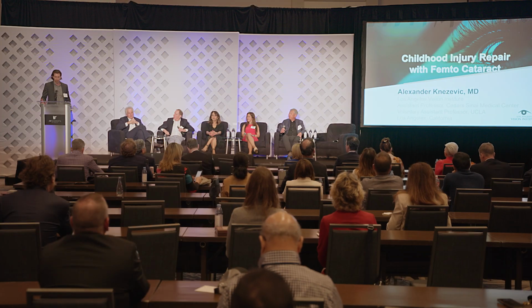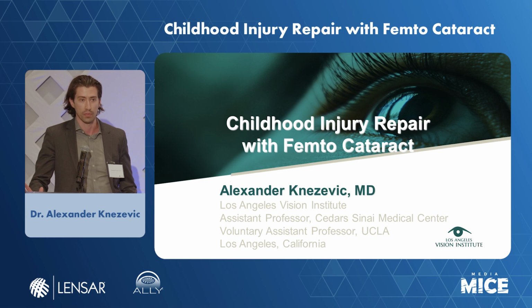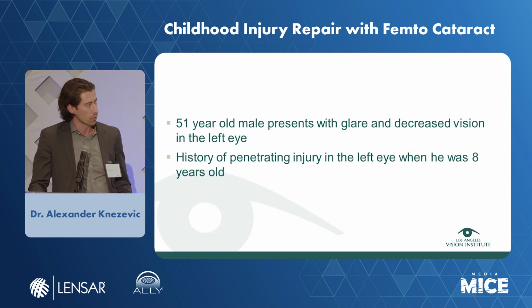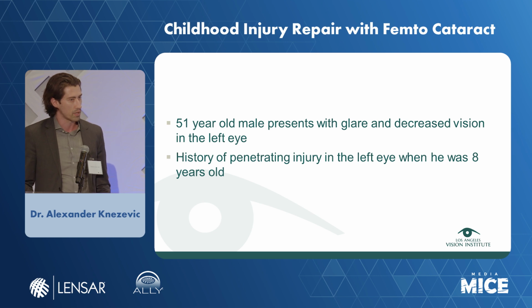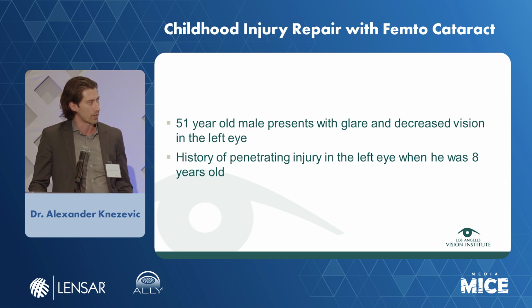Most of us in this room are using premium technologies to achieve premium outcomes, and often this is in routine cases. These things are also possible in complex cases. So this was a 51-year-old male who was referred to me for evaluation of his cataract, and he had a history of a penetrating injury to his left eye when he was 8 years old.